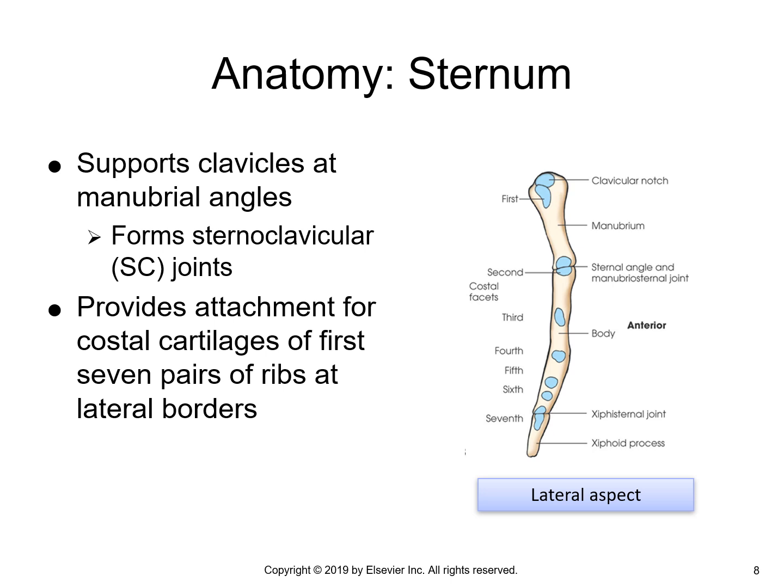are found on the side of the sternum. So the sternoclavicular joints at the top of the manubrium are of particular importance. We'll have special radiographs or projections to learn to isolate sternoclavicular joints. Those are also going to be slight obliques.